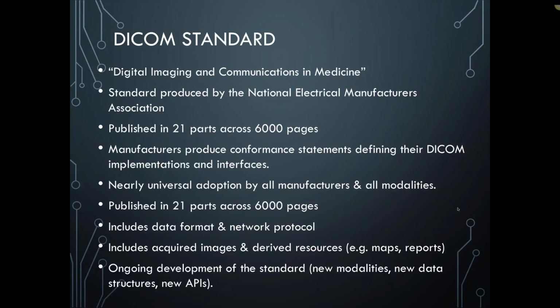So something, for example, like a structured report or a tractography map can all be stored in DICOM objects. It's a standard that is ongoing in development to support new modalities, new communication protocols, new data structures. It tends to be a slow and laborious process for new capabilities to be added to DICOM, and that can be often to the frustration of those of us on the research side who need things to move a little faster, but is somewhat necessary for clinical communications.